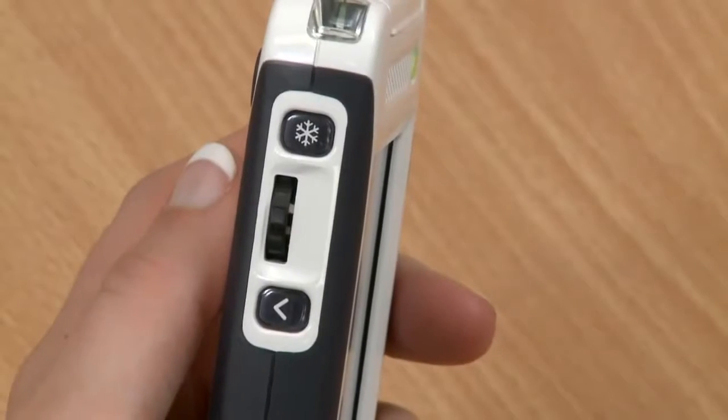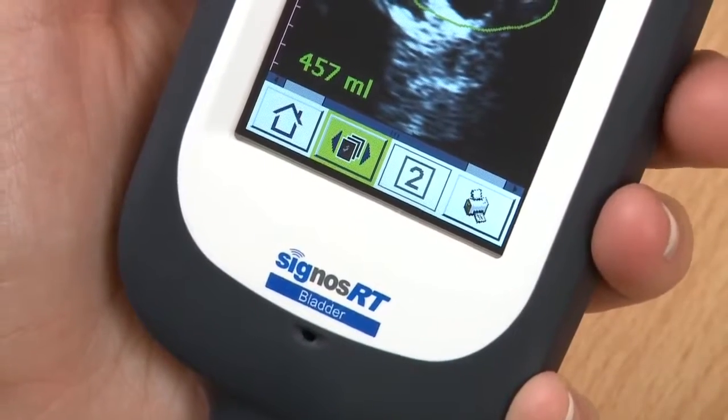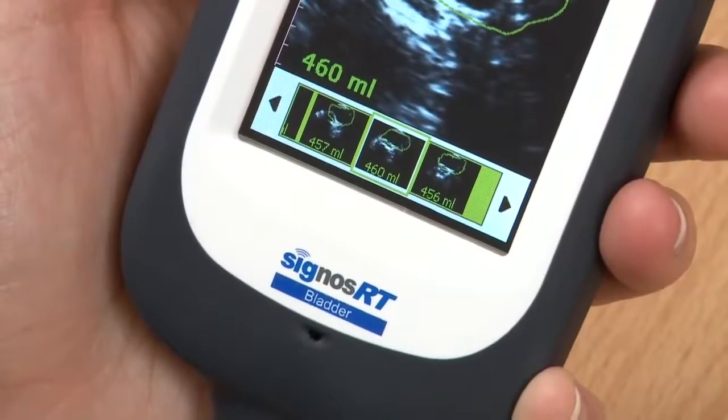You can view all your images and measurements by selecting the image scroll button at the bottom of the screen. Use the scroll wheel to scroll through the images.